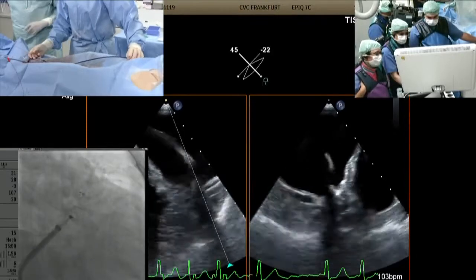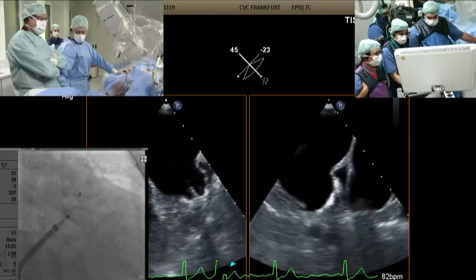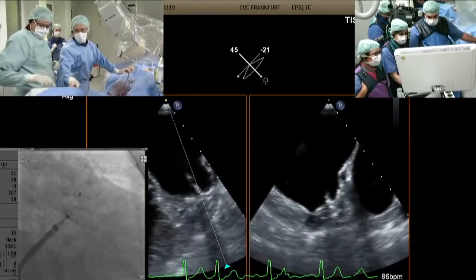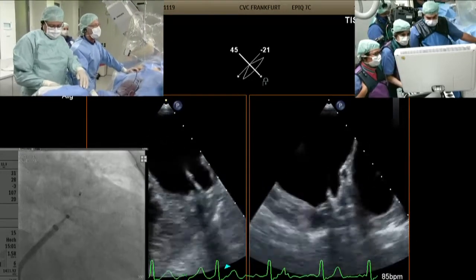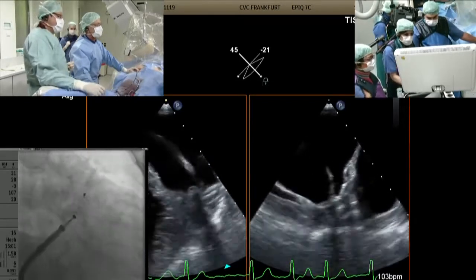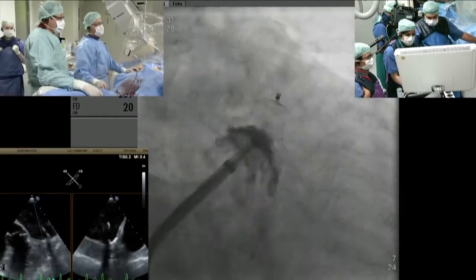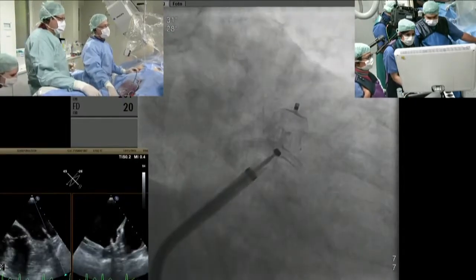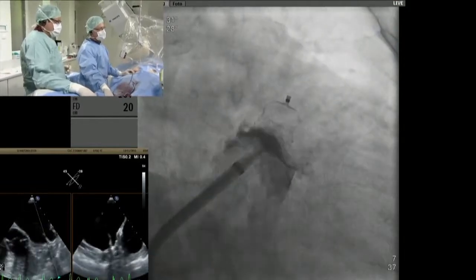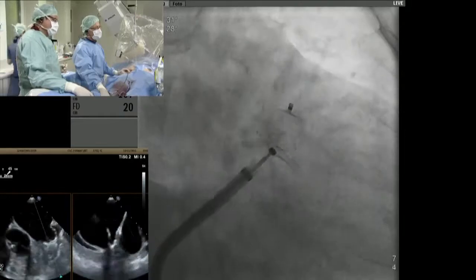Oh, all right. Well, we see the disc is probably too small, but can you go to 9.9 again? Yeah. Little angiogram now, I think. Yeah, it's too small, huh? You see the gap at the inferior edge. Yeah. That's small. So the superior lobe is still patent. Jens, what would you do now?